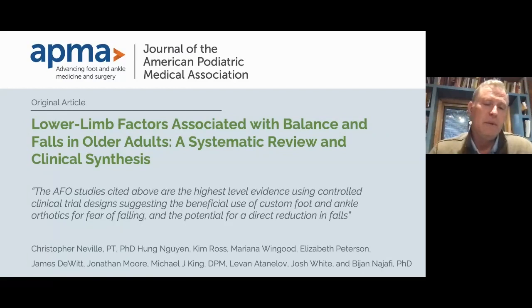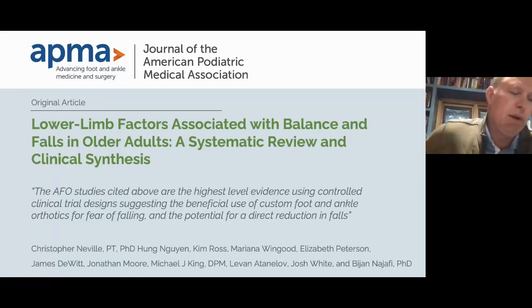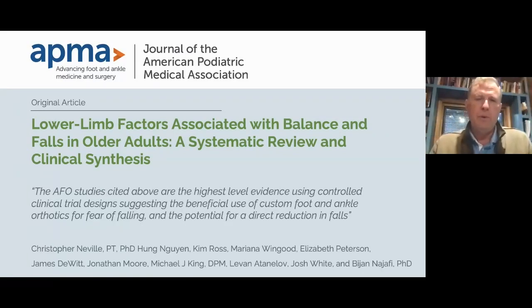So, and this is the coup de grace of what we accomplished through the Falls Council. We produced a paper that was published in the Journal of the American Podiatric Medical Association, demonstrating, of course, that lower extremity risk factors were vital and key for fall prevention. And among those things that we determined was that AFOs, again, can be a vital part of improving the risk factors that are related to the foot and ankle.